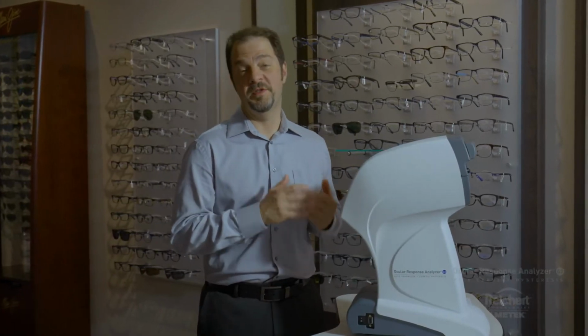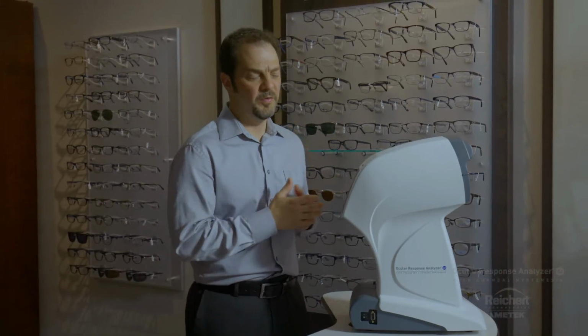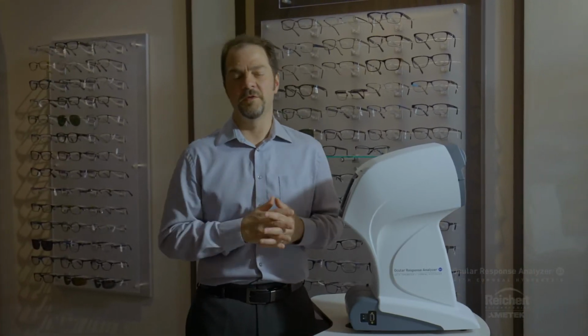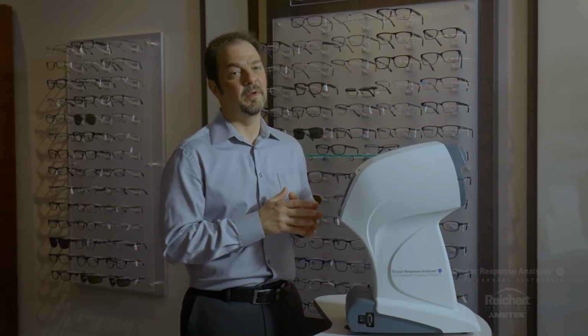Another frequent question we get is related to asymmetry between the two eyes, particularly with the IOP measurements. Some people will say, well, I always get the same value in the two eyes on my patient with a Goldmann tonometer, and with this device sometimes I get 2 millimeters of difference, 4 millimeters of difference, 5 millimeters of difference between the two eyes. Why is that? The answer is twofold. First of all, it's important to understand that this measurement happens very rapidly. The measurement is over in 25 milliseconds. And this is at random to the ocular pulse. So every time the heart beats, there's a small pressure change in the eye. On average, that pressure change is about 2.5 millimeters, but in some patients, it's as high as 6 millimeters.